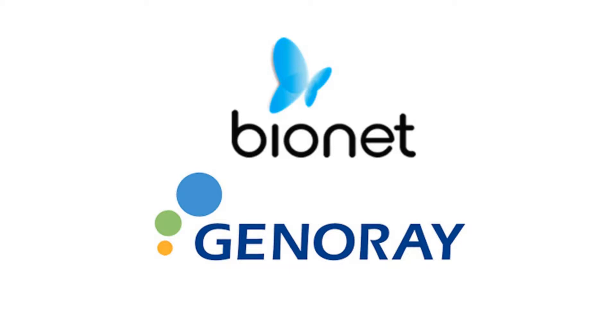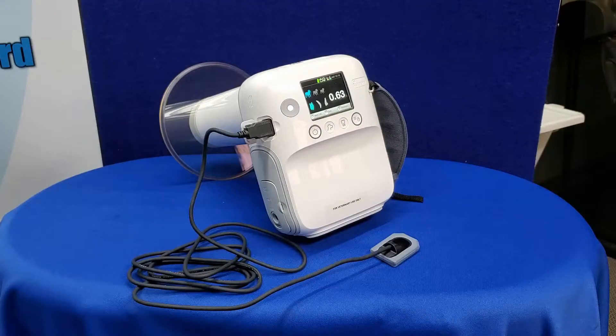Setting the new standard in veterinary handheld dental x-ray solutions, Bionet and Generay are pleased to announce the Zen PX4 VET and PortView intraoral sensor.